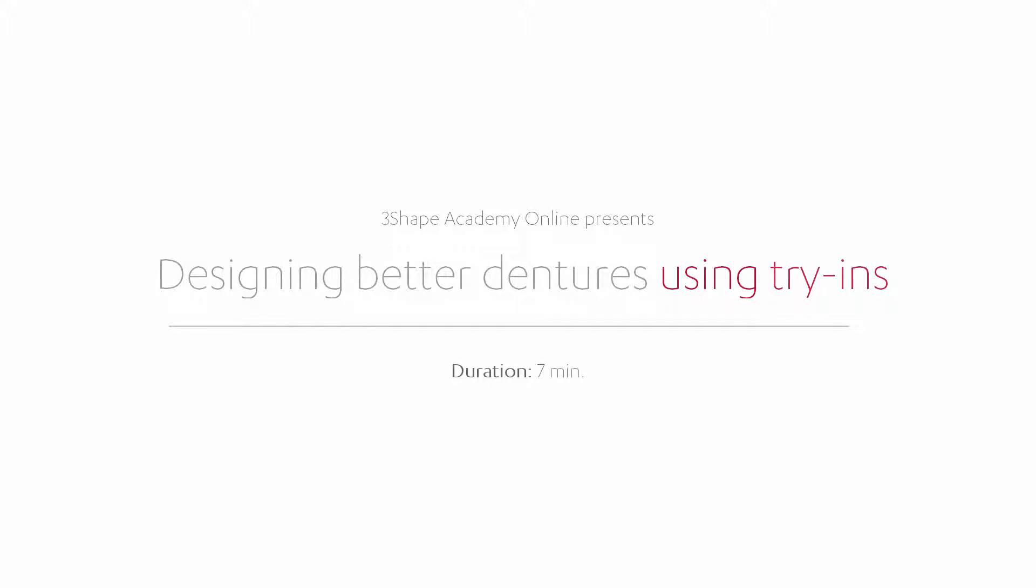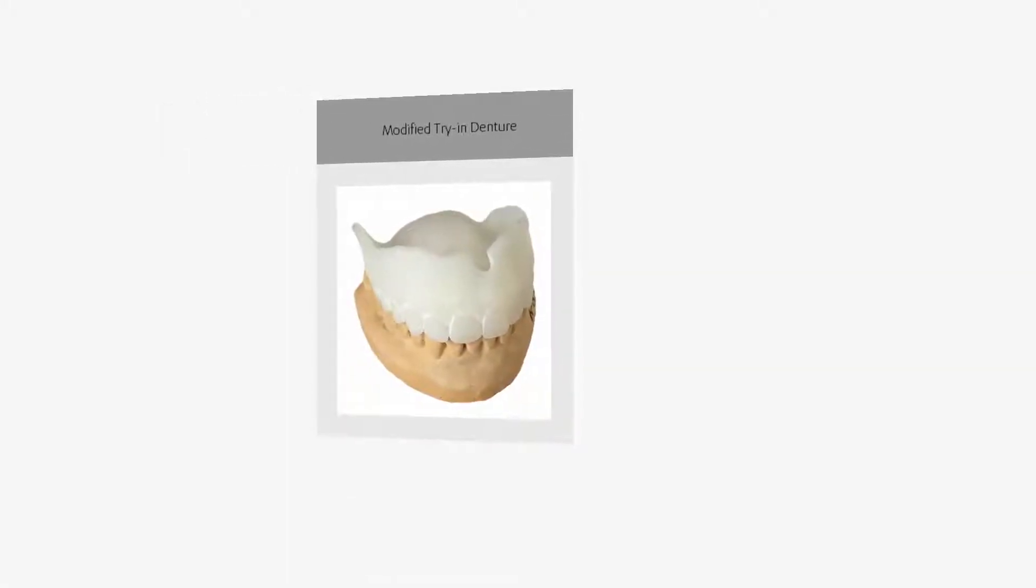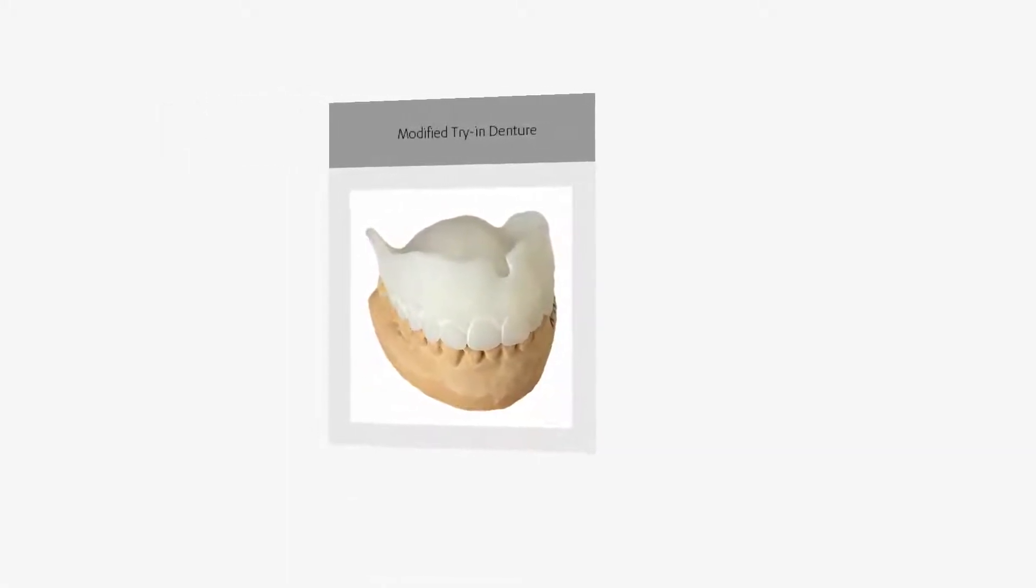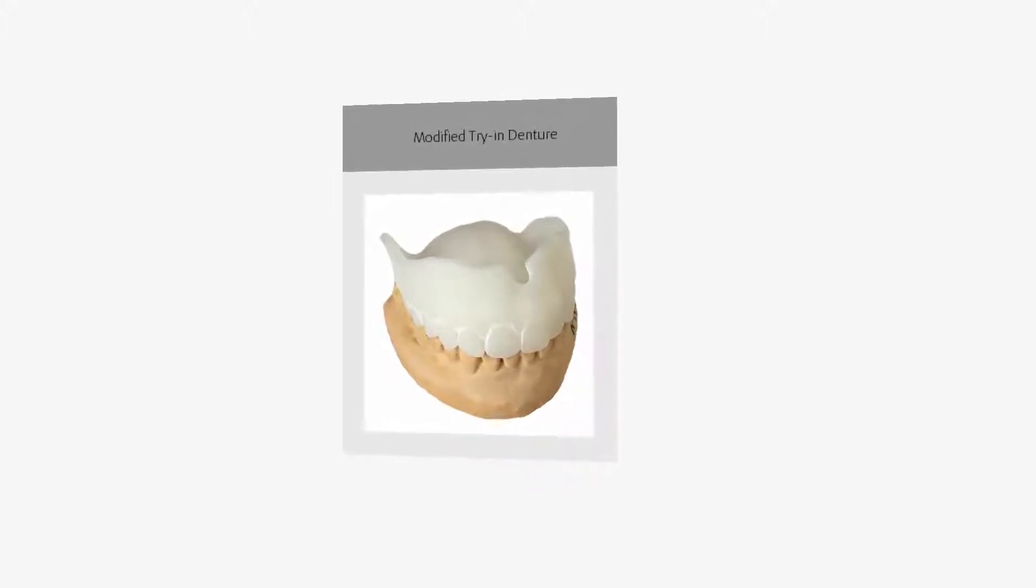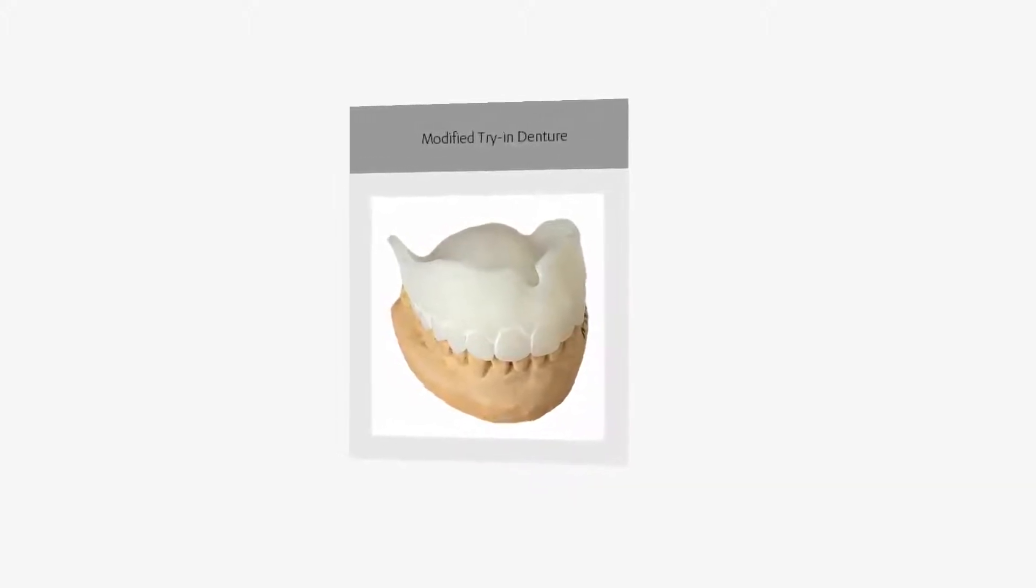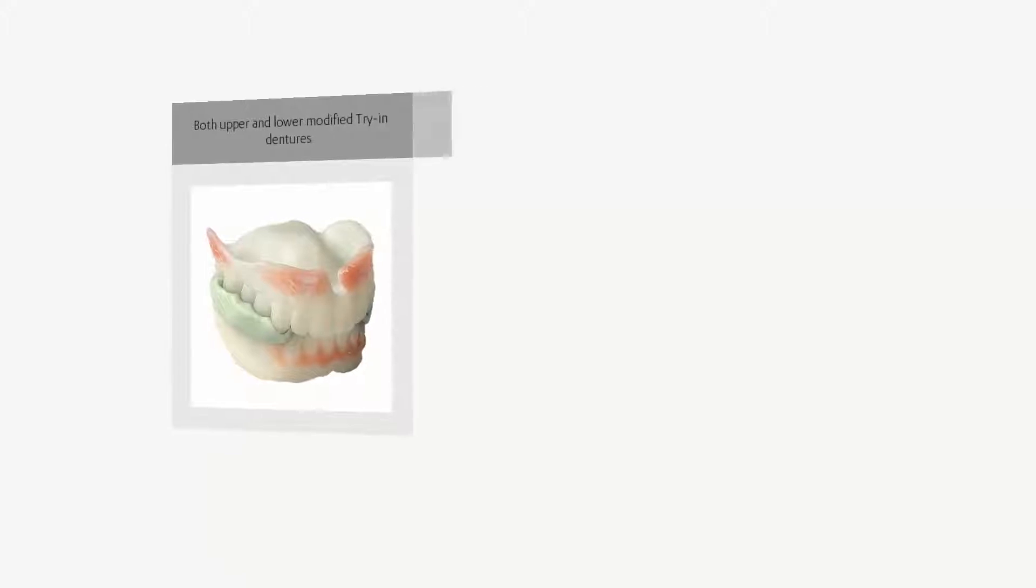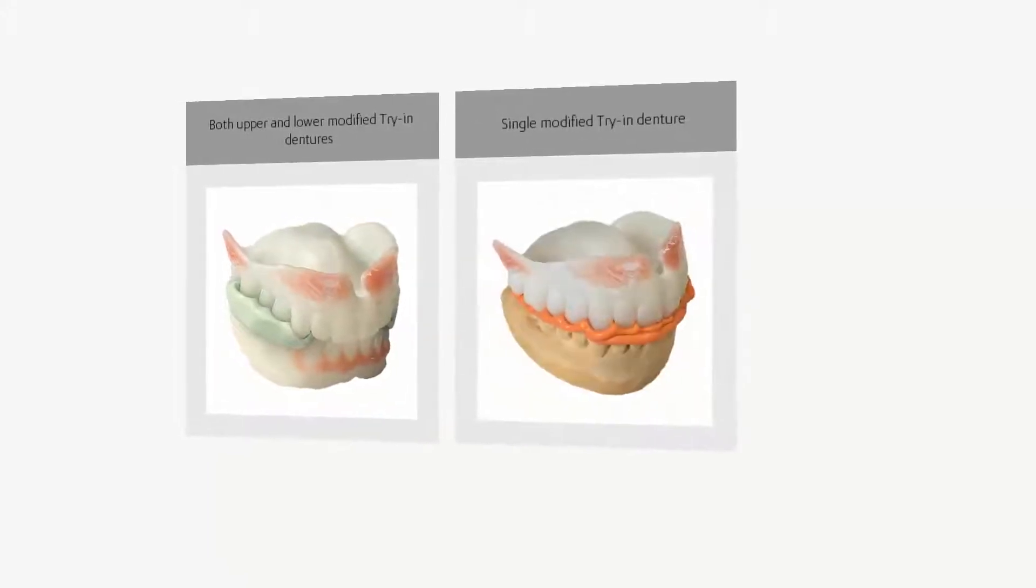While watching this video you will learn the steps for adding the information from a denture try-in to an existing order after having the denture checked and adjusted in the patient's mouth. The procedure described is valid for upper and lower jaw denture cases as well as single jaw cases.